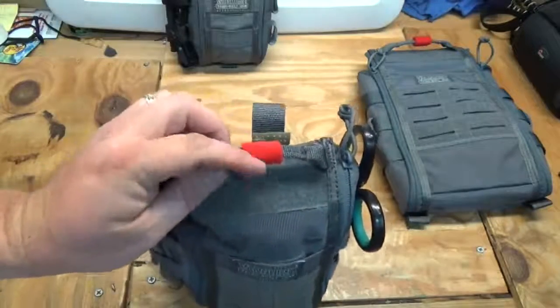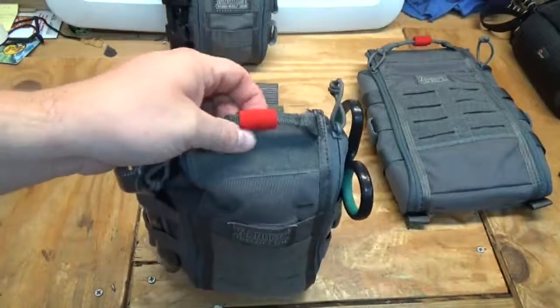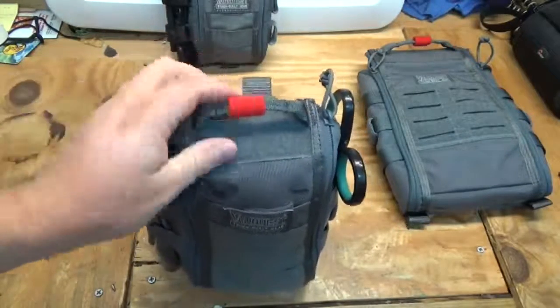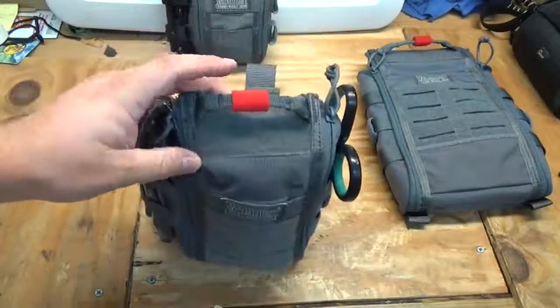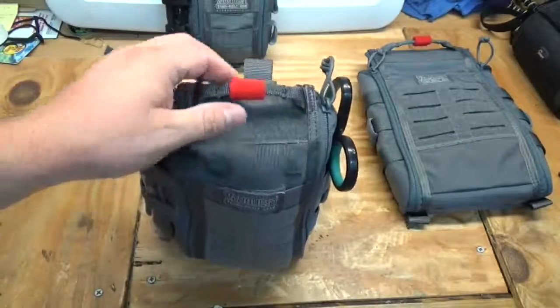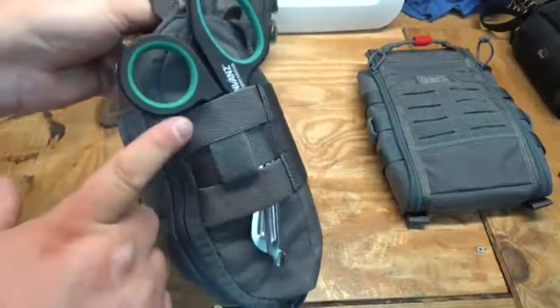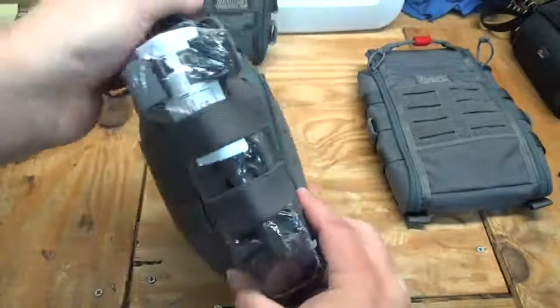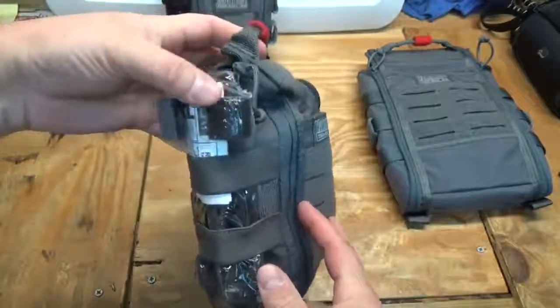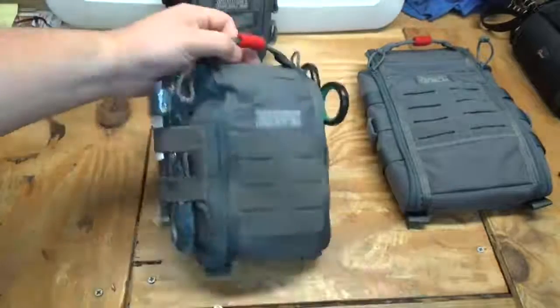You also have this nice tab that signifies it as a medical kit, which you can take off — it's kind of like velcro, removable. On the front, some other changes: you have elastic on the sides, which is really nice. There are two loops of elastic on each side. On this side I have my CAT tourniquet — a brand new one, haven't even taken it out of the package — it fits right in the elastic.